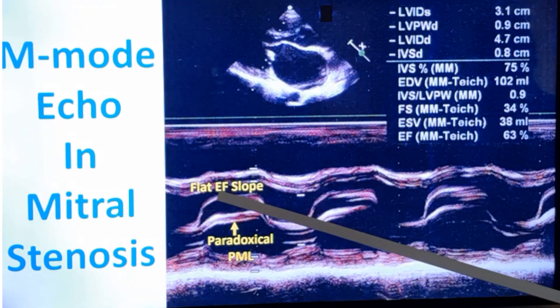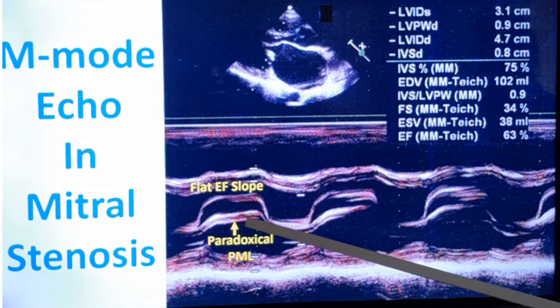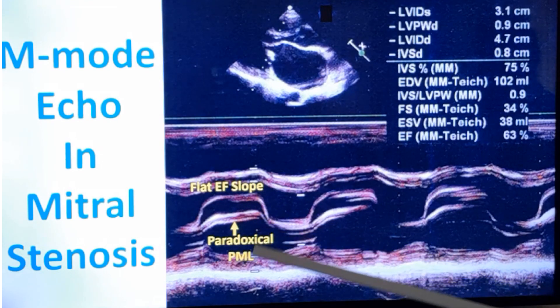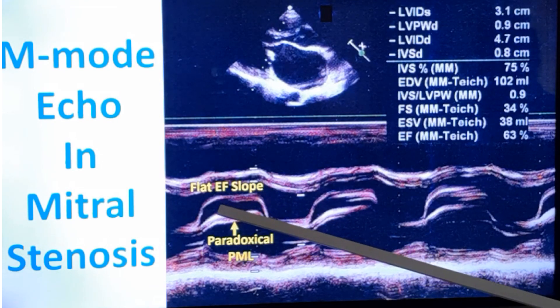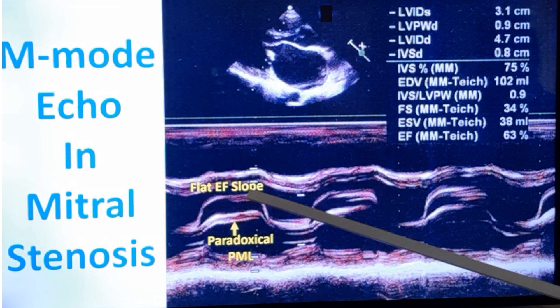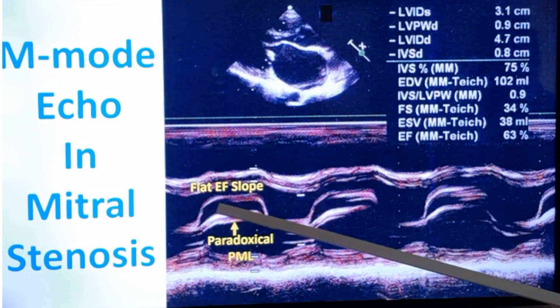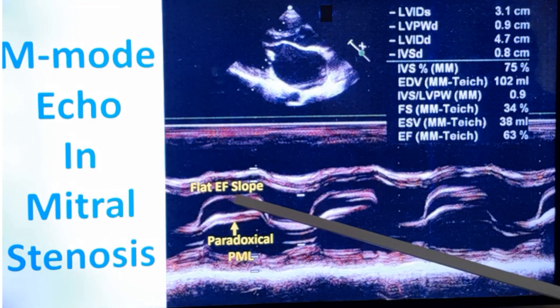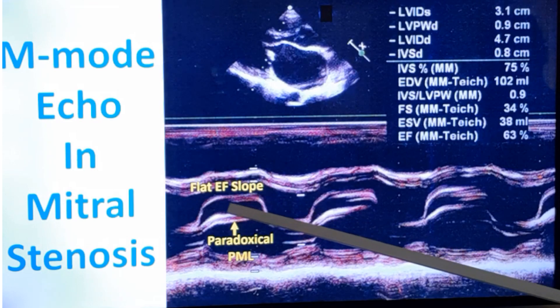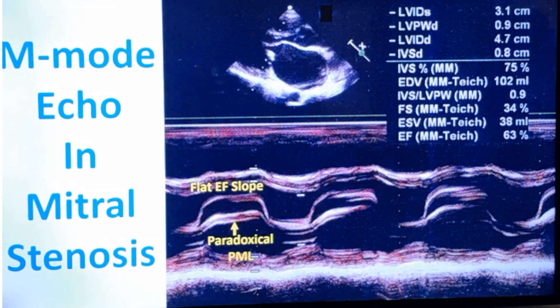Normally the EF slope should be downwards, followed by an A wave. Here, there is no A wave, and the EF slope is flat — almost a horizontal slope — whereas normally you would expect it to slope downwards in early diastole.